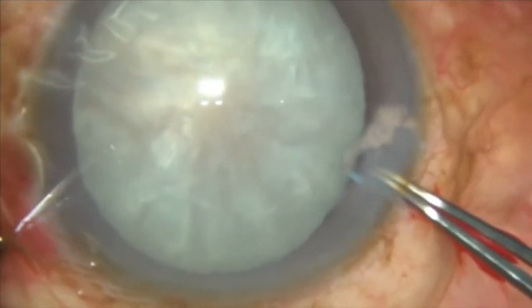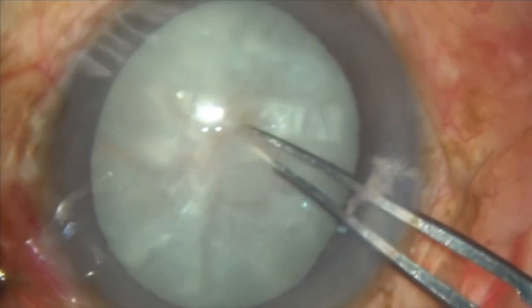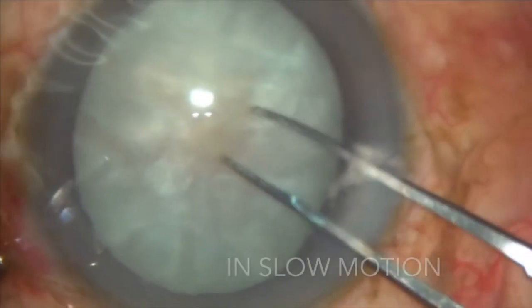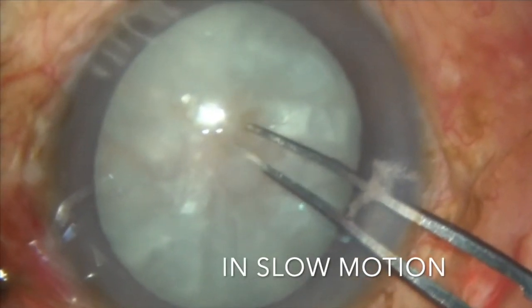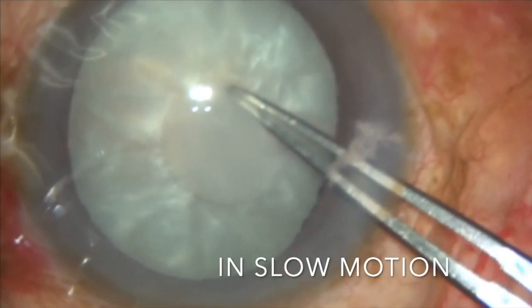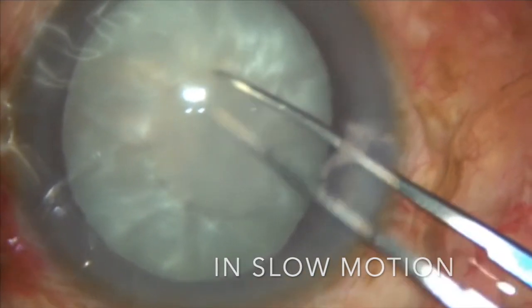This technique allows controlled capsulorhexis in eyes with raised intralenticular pressure. Once the flap is lifted and everted on an unopened capsule, the rhexis will not extend peripherally, as the forces of opening are not directed equatorially.